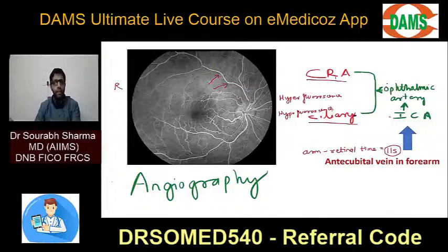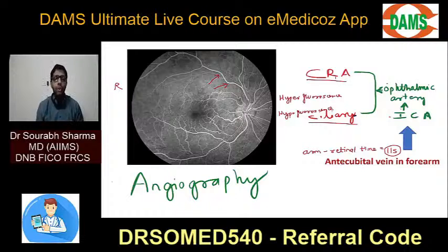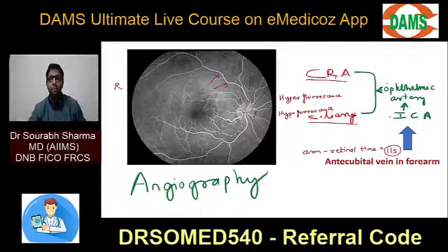Why is the choroid dye not coming into the retina? Because of the outer retinal barrier. That is what angiography is all about: the dye should remain in the retina and choroidal vessels. It should not come out in a normal angiography. So the retina and choroidal vessels are hyperfluorescent.